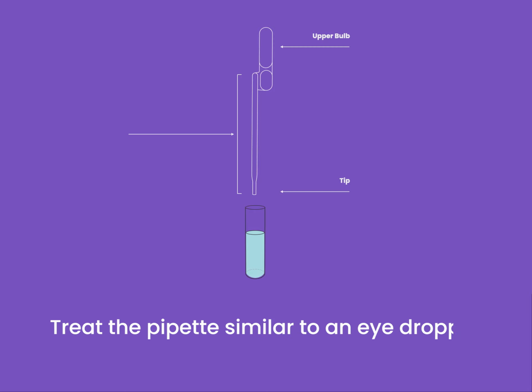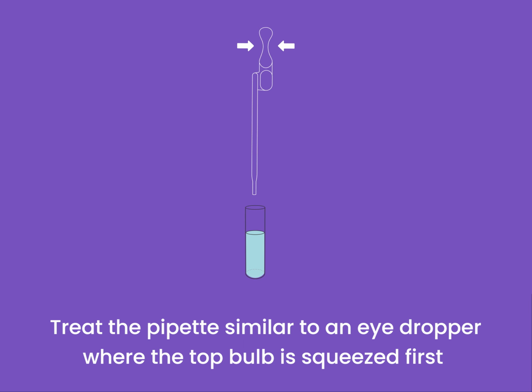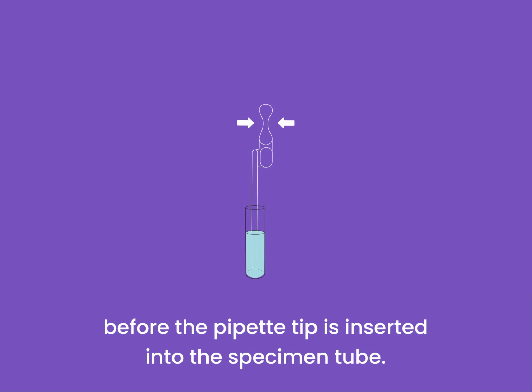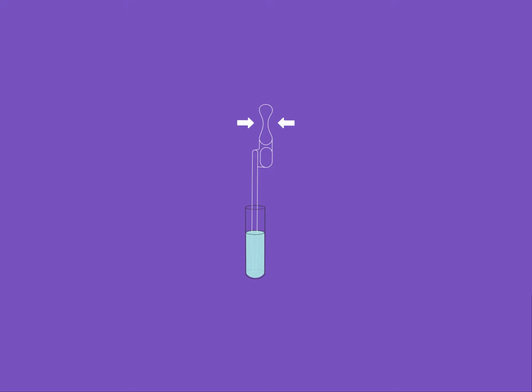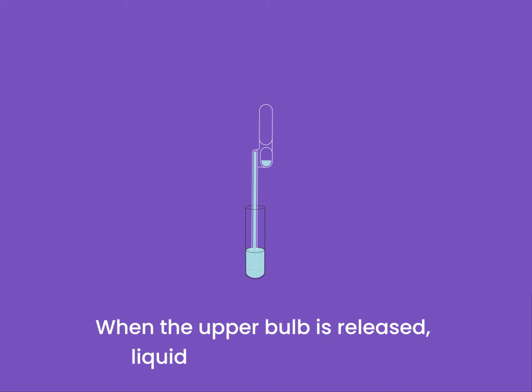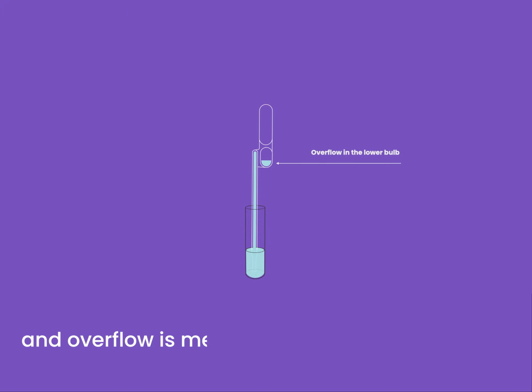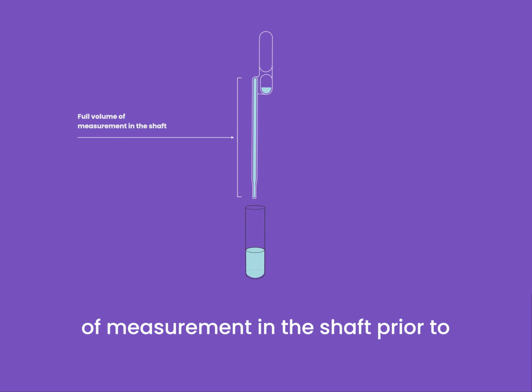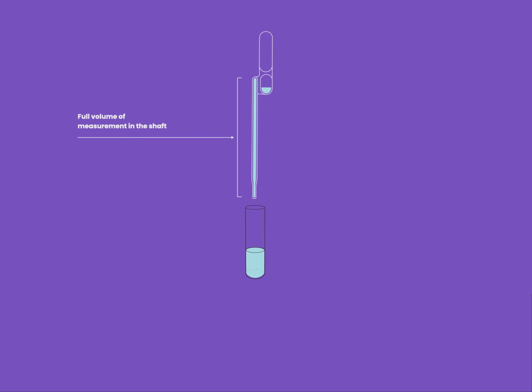Treat the pipette similar to an eyedropper where the top bulb is squeezed first before the pipette tip is inserted into the specimen tube. When the upper bulb is released, liquid will flow up the shaft and overflow is meant to fall into the lower bulb. It is meant to remain there because it helps to ensure the full volume of measurement in the shaft prior to loading the sample into the device.